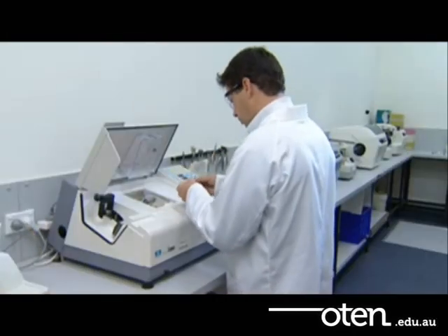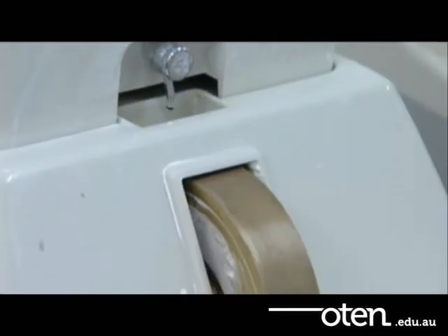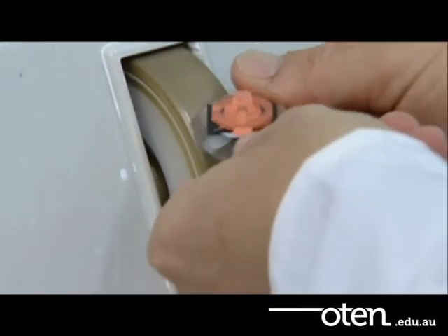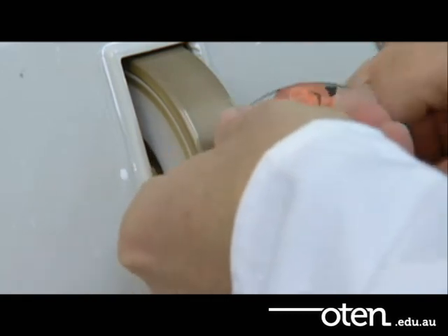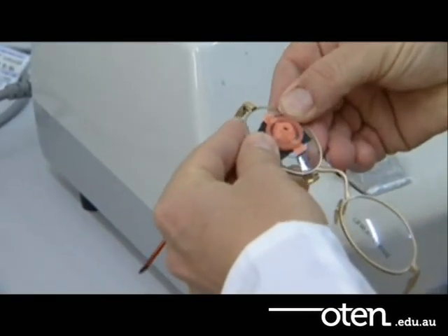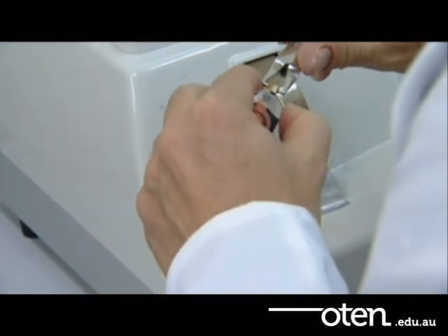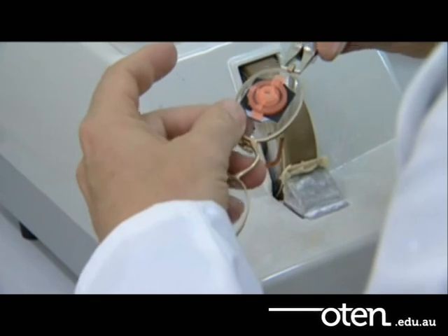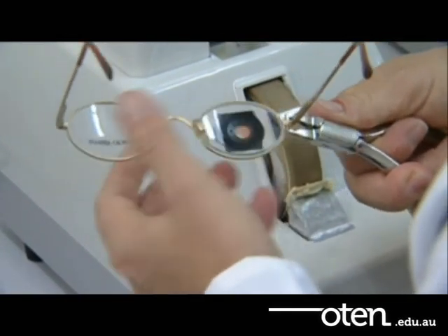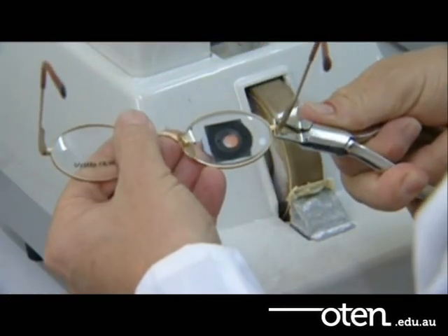Remove the lens from the edger. The lens then moves to the V-wheel where the bevel is formed. Chamfer it by hand. Then check the size of the lens in the frame by using pull-up pliers to gently bring the rim locks together. If the lens is still a little large, it can be recut or trimmed down on the edger by altering the size. These steps are then repeated for the left lens.